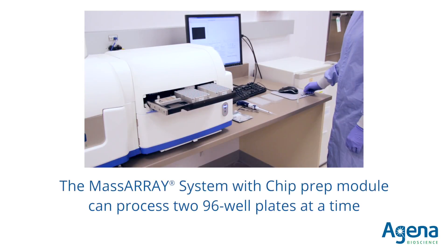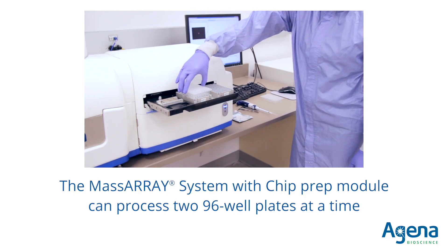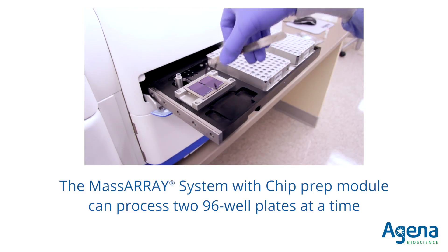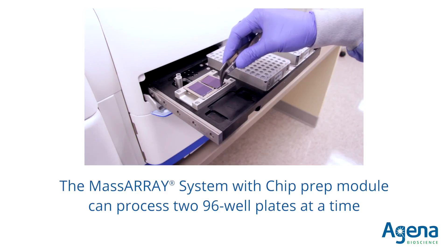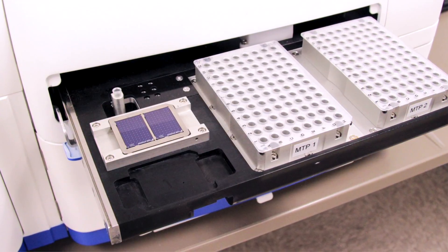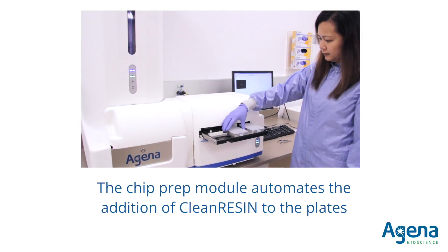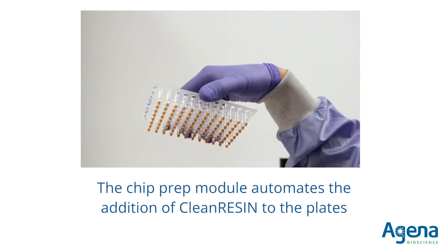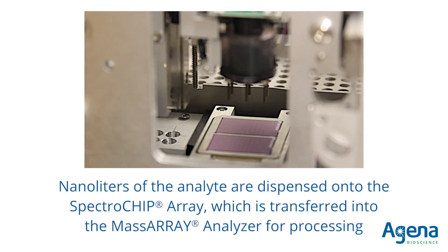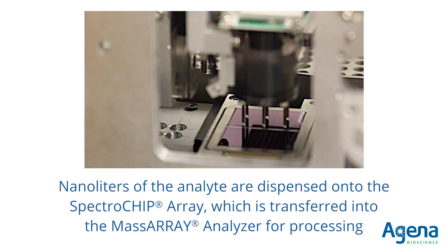The plate is now ready for processing. The MassARRAY system with chip prep module can accommodate two 96-well plates at a time. Once the reaction plates are placed on the CPM deck, sample processing is fully automated. Clean resin is added to minimize the effect of salts in the reaction. Nanoliters of the analyte are then dispensed onto a SpectroCHIP, which is transferred into the MassARRAY analyzer for processing.